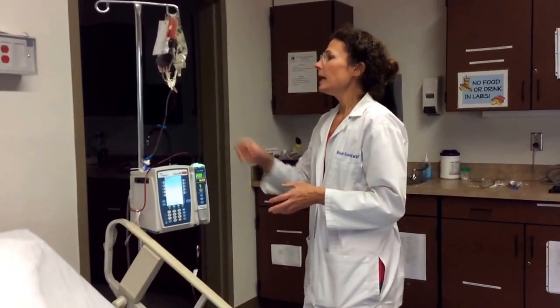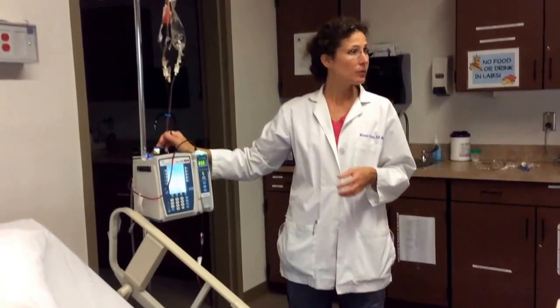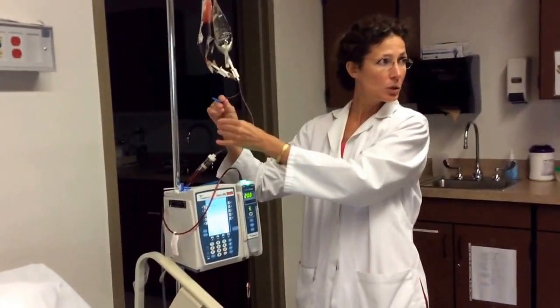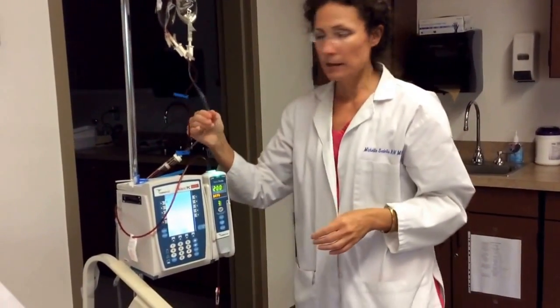All right, so within an hour and a half, we enter the room and we see at that time that this blood bag is dry, okay? So at that time, I would close off the tube to the blood, and I would open the tube to the saline.